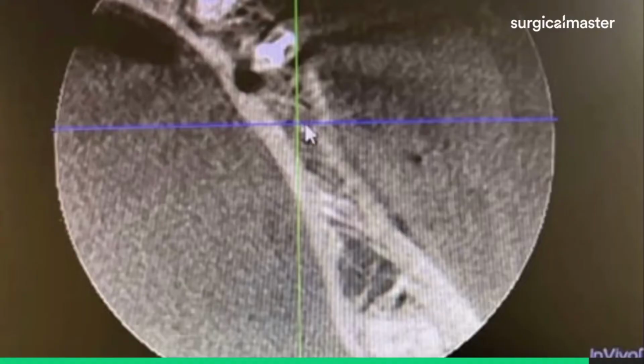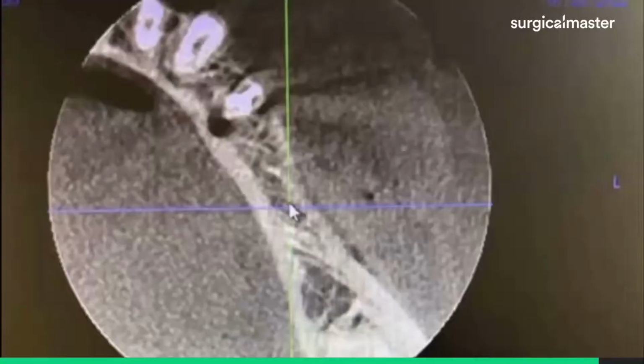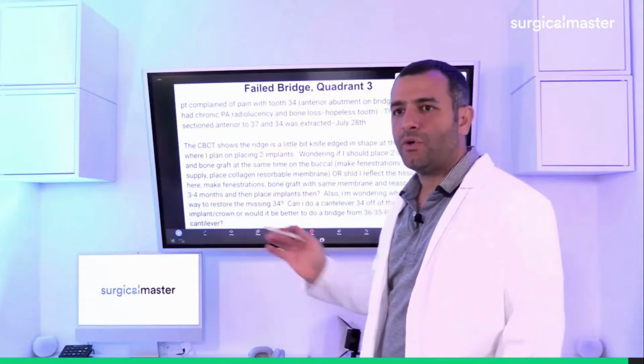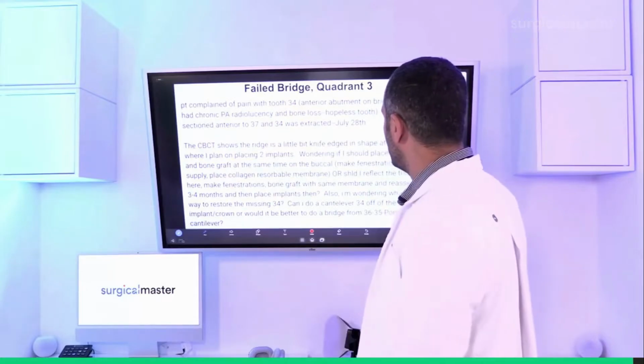And then I can tell you, this is a case where you don't want to place 3 implants, or you do want to do 5 implants. You want to extract another tooth and do a strategic extraction so you have multiple implants. Rashad, give me some advice here. How can I create more value here? Let's go back to the doctor's question, and let's dig and see what their thought process is, and see if they're in a position to tackle this or maybe go back to the drawing board.